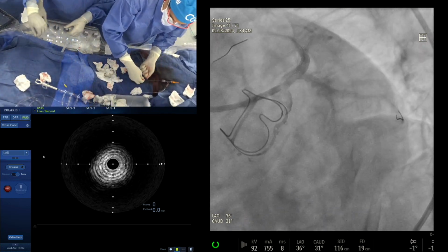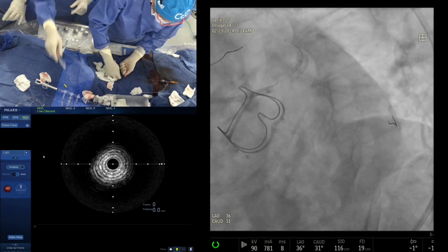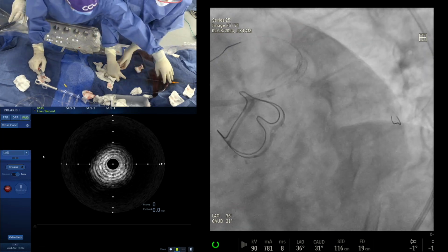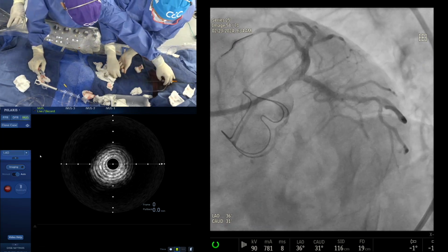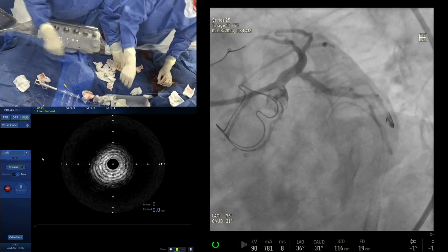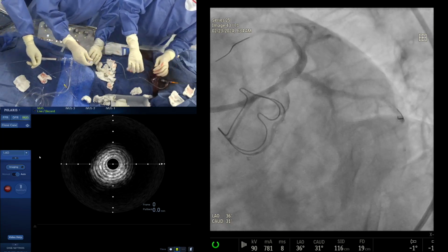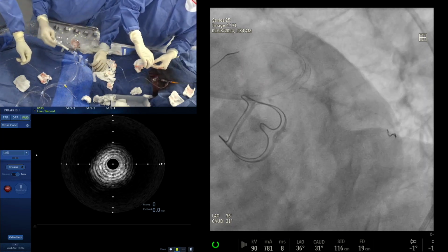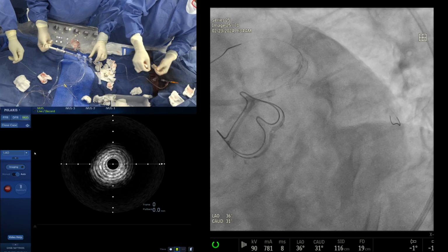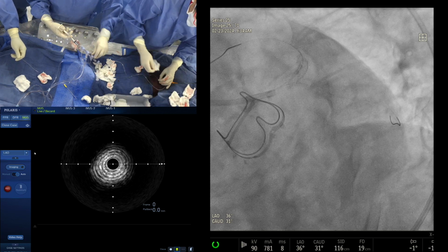Prof, if I can ask, as far as left main stenting is concerned, is there a need to come up to the ostium, or are you happy leaving the stent in the body of the left main? I think if the ostium is completely normal, it's better, because, one, you'll deform the stent many times with a guide catheter. Second, when the patient comes back with stenosis trouble, but if there is even a little bit of a dent, which I call a beaking, then you go up to the ostium. I know in Europe they all want to go up to the ostium. We do not. We say that little beak, yes.